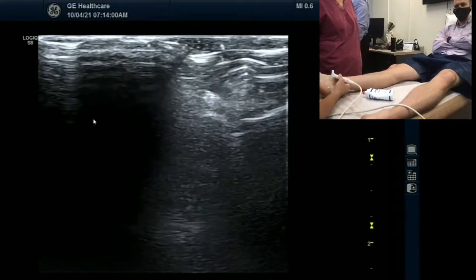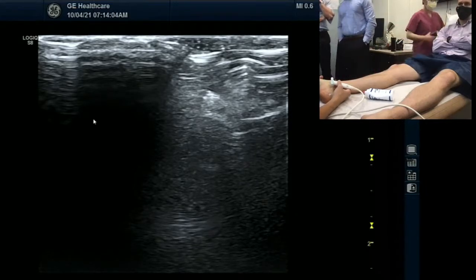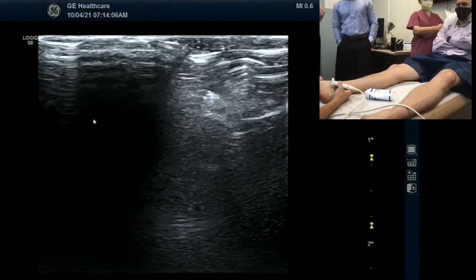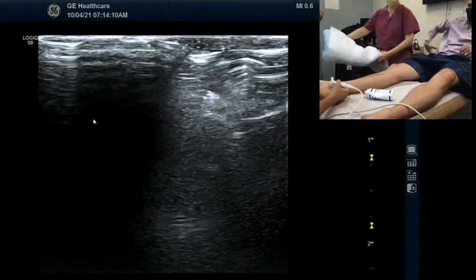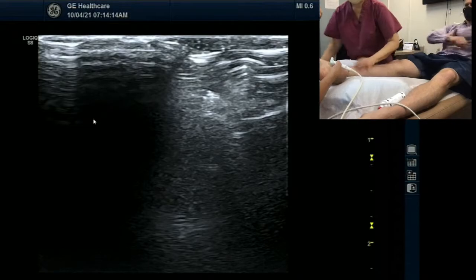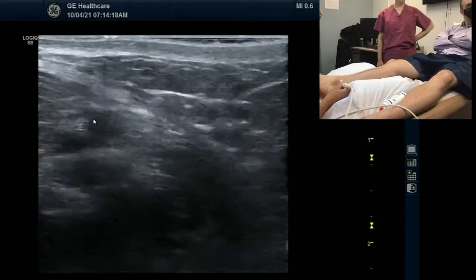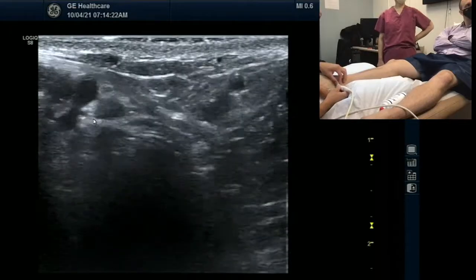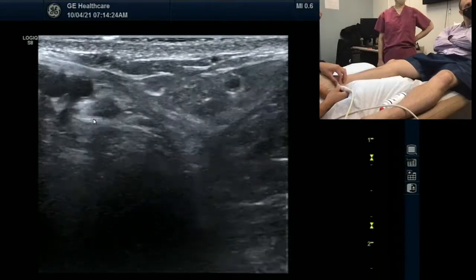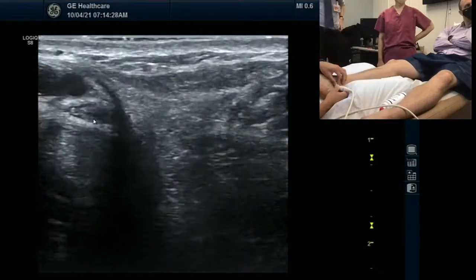Do we have a bolster? I can get a towel. Because I want to stretch out his area. Are you comfortable with Patrick? I see a branch coming off the posterior part of the tibial nerve and I just wanted to see where that goes.